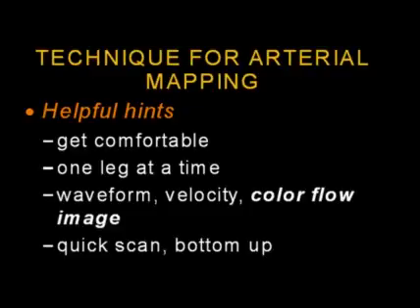Use all of the information that's available, the waveform information, the velocity information, as well as the color flow image in order to create your arterial map. And then we use two other techniques, and that is a quick scan technique in the thigh and a bottom-up technique in the calf, which I'll elaborate on shortly.